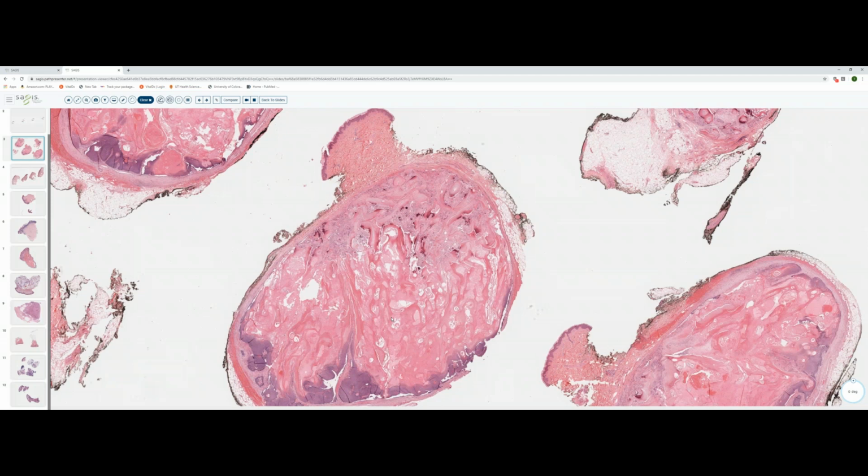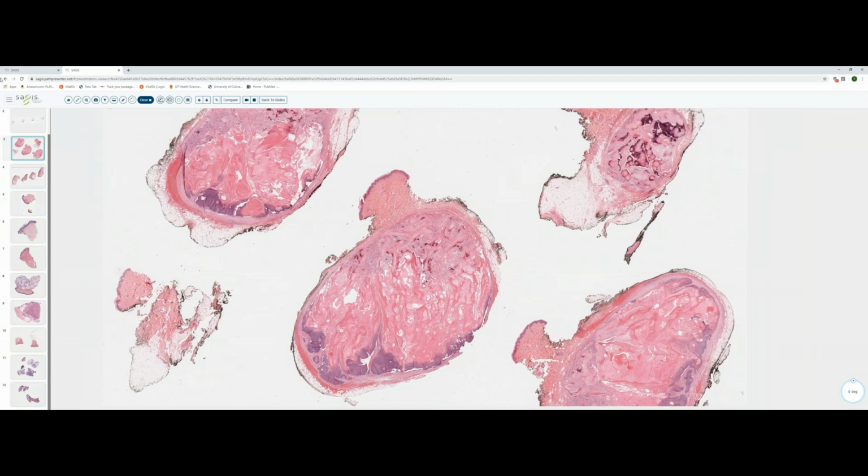The second type of follicular cyst that we see is the isthmus-catagen type. That resembles more the outer root sheath epithelium or the isthmic portion of the hair follicle. You get abrupt keratinization without interposition of a granular layer. And while it's lined by stratified squamous epithelium, the keratin centrally has that homogeneous appearance. Think of a pilomatricoma as a matrical cyst. It begins as a cyst that's lined by this matrical epithelium that forms keratin that is like that of the hair cortex, in other words, shadow cells. So, pilomatricoma.